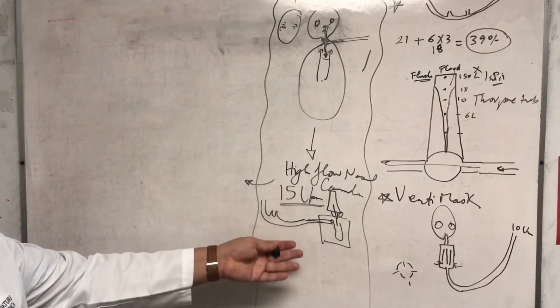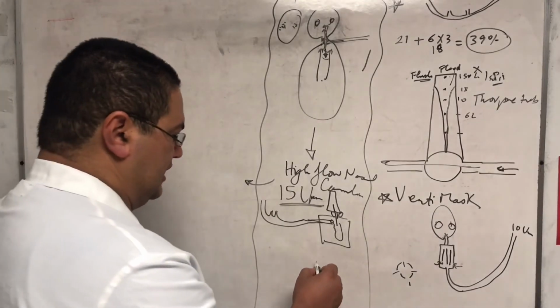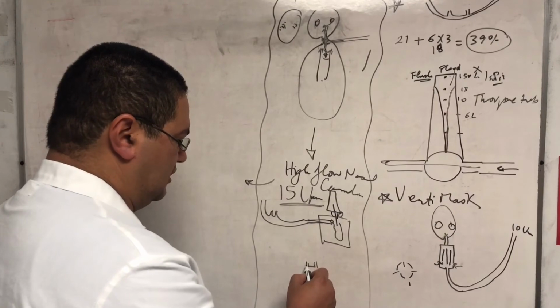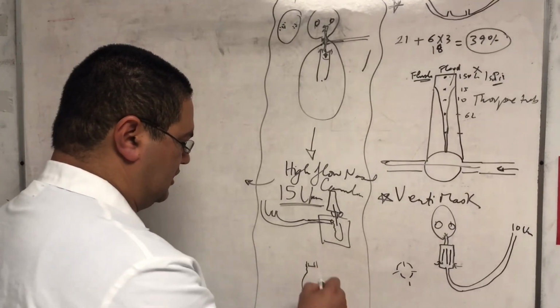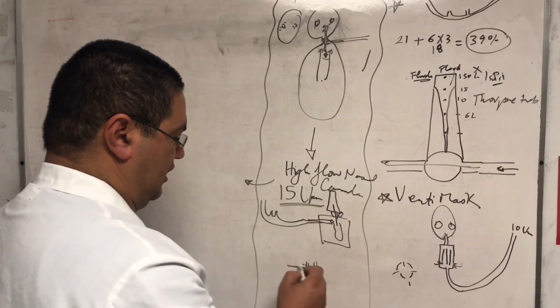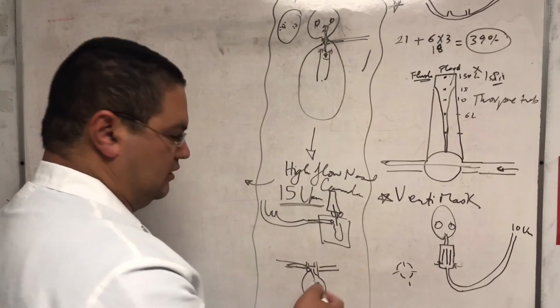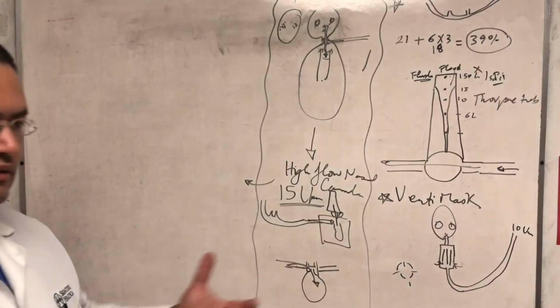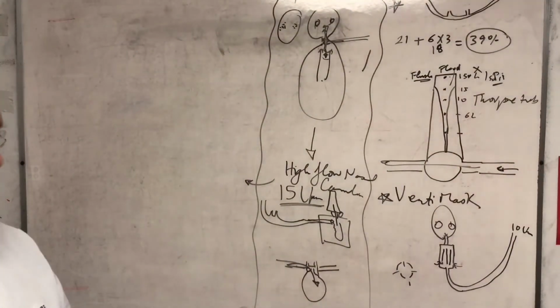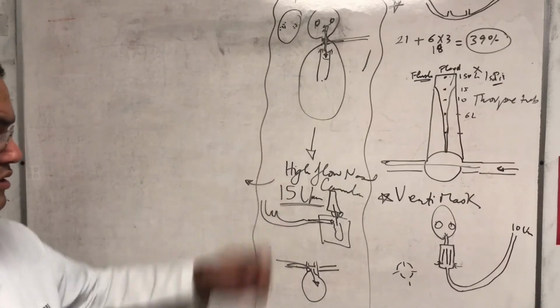There is also the Oximizer, a nasal cannula that has almost like a bag like this. It keeps some oxygen stored in the bag, and the nasal cannula sucks from the bag, similar to this a little bit.